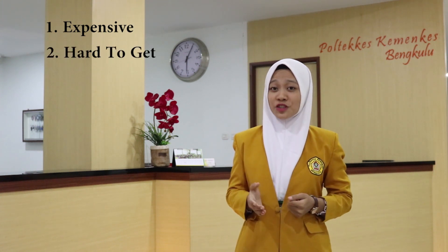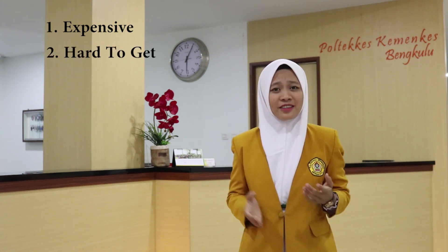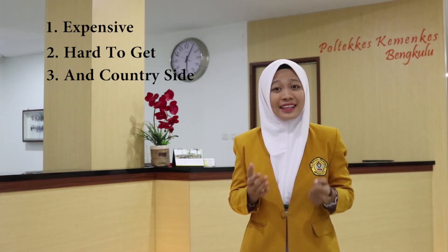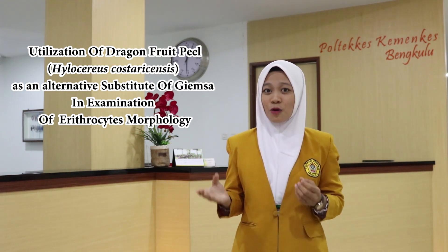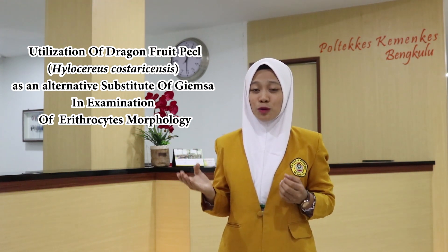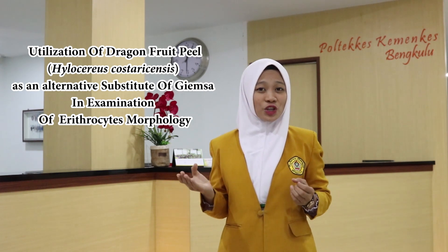Expensive, hard to get, and limited availability in the countryside are the problems in obtaining reagent for plasma examination, especially in the examination of the morphology of erythrocytes. So from this problem comes the idea about an innovation in the creative industry: the utilization of dragon fruit peel extract, or Hylocereus costaricensis, as an alternative substitute for Giemsa stain in the examination of erythrocyte morphology.